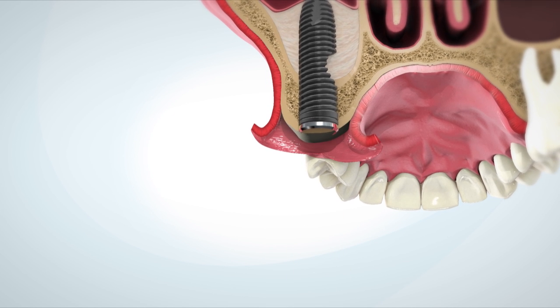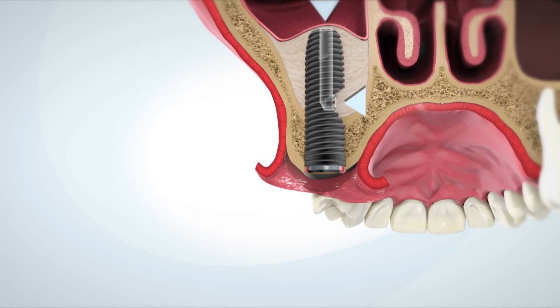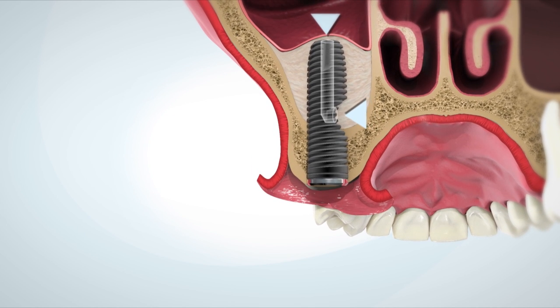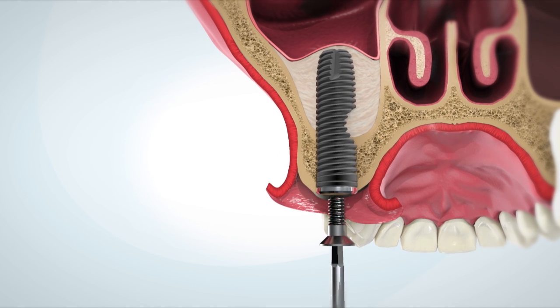The novel design of the channel ensures that both openings are embedded within the jawbone, thereby preventing bacterial migration from the oral cavity into the sinus. Insert the cover screw and suture the gingiva.